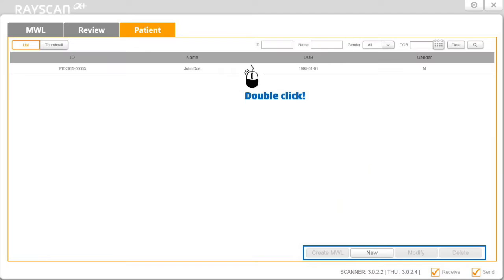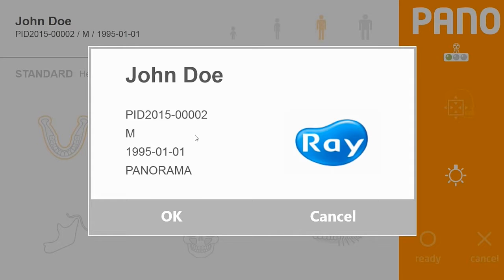Double click on the patient and the screen will switch to the acquisition interface. First you'll see the patient information; simply click OK.